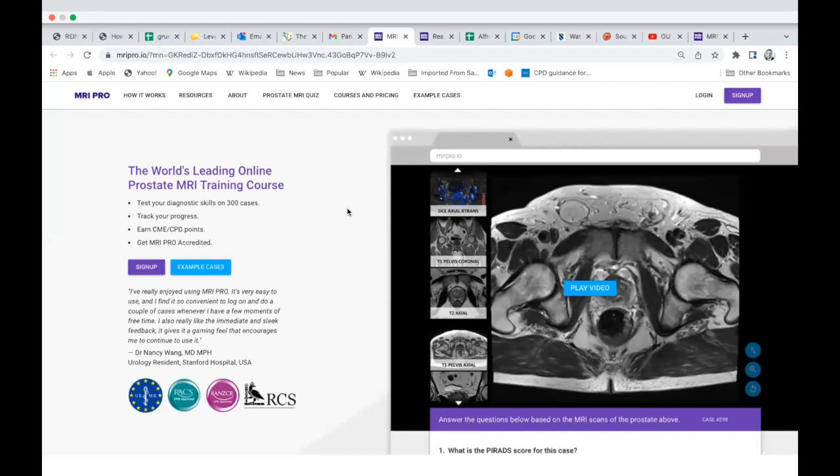Welcome to yet another free webinar brought to you by MRI Pro. My name is Jeremy Grummet, one of the co-founders of MRI Pro. I'm also a urologist at Alfred Health and Monash University here in Melbourne, Australia. Now, for those of you who don't know much about MRI Pro, it's an online learning platform of 300 cases of prostate MRI, each one of them with full histological verification.